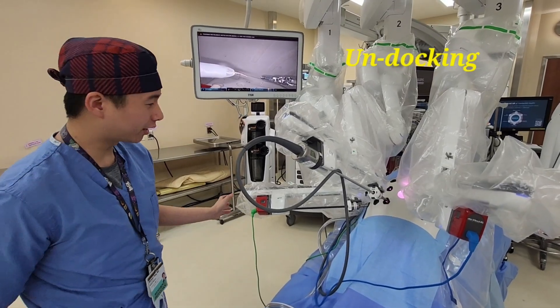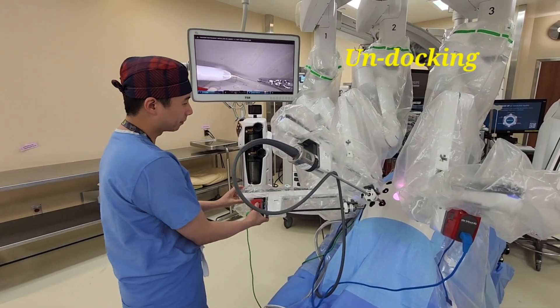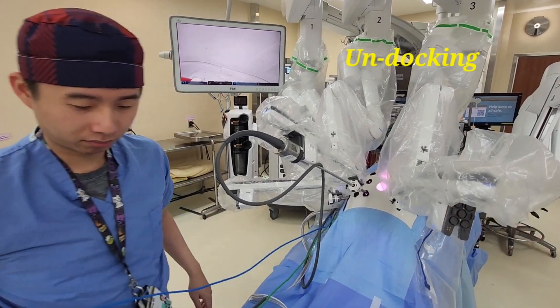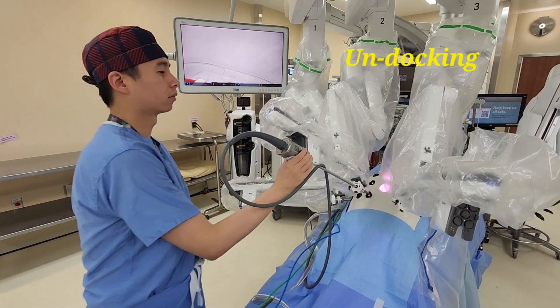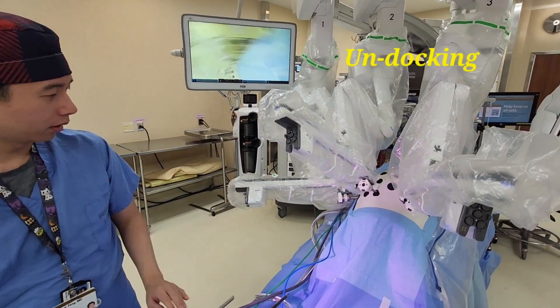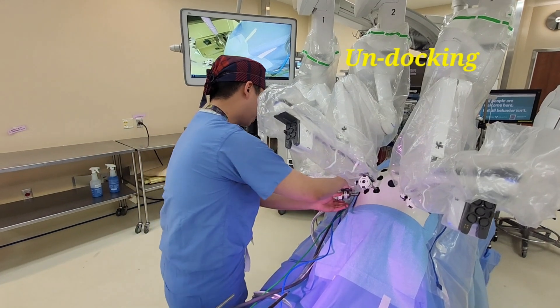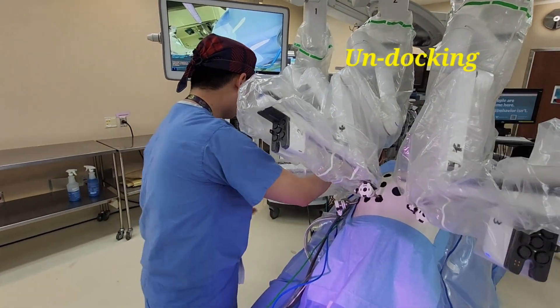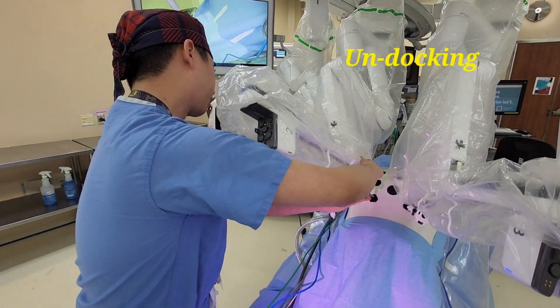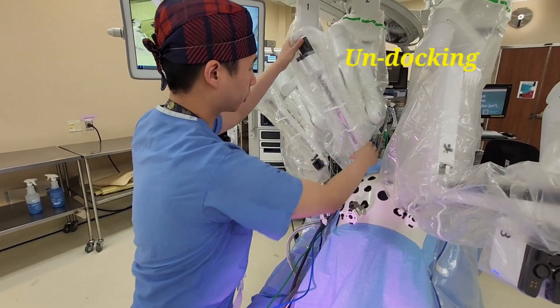Finally, when the case is done, take out the instrument and camera, then detach the robot from the port itself to assist the circulator in moving the robot out of position.